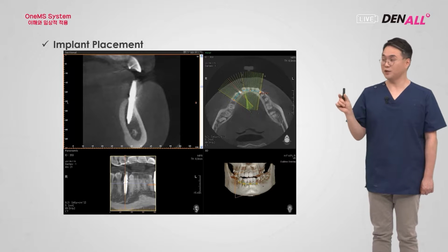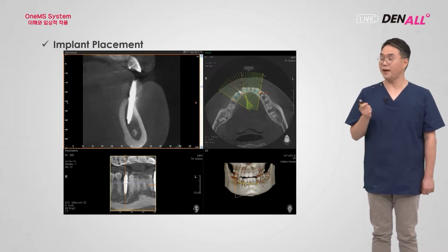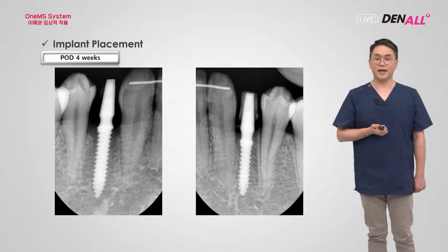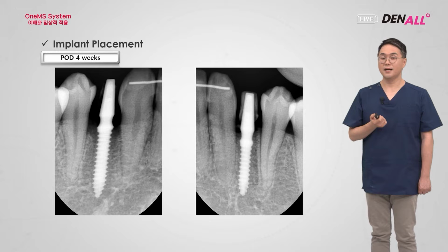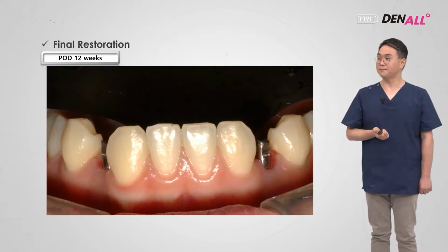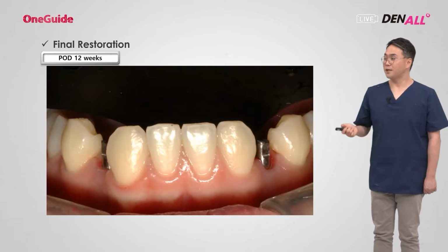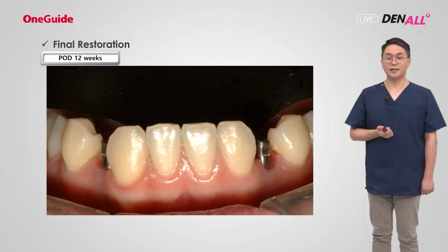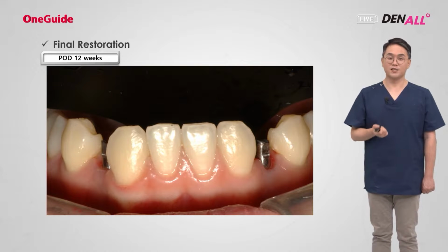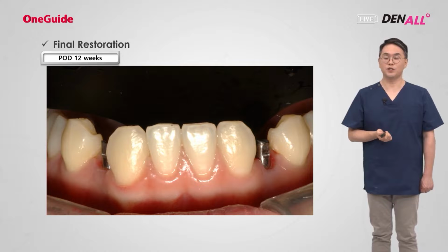As you can see, the bone width was very narrow, but it went very well. And this is 4 weeks post-op, not much of a problem. The integration is happening very smoothly. This is 3 months post-op. When I delivered the final prosthesis, the gingiva was healing very well. I did not open a flap. The papilla is also maintained very well.